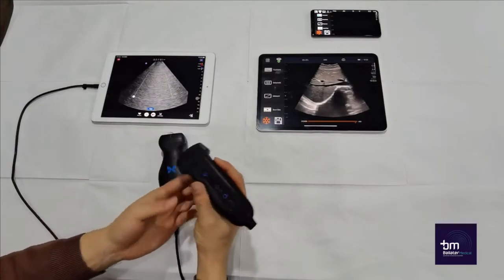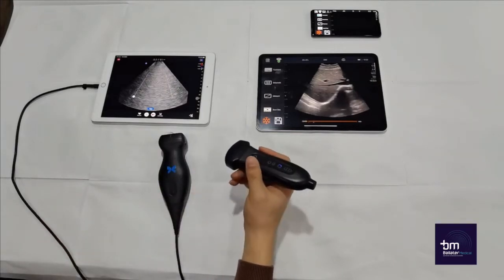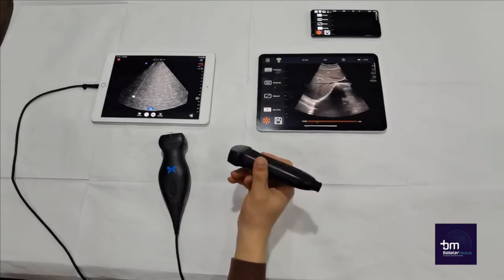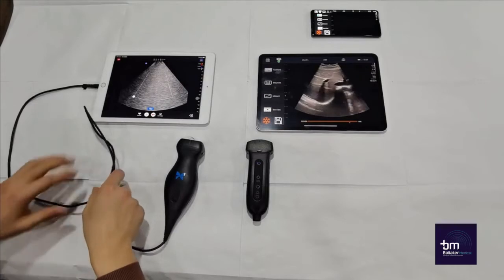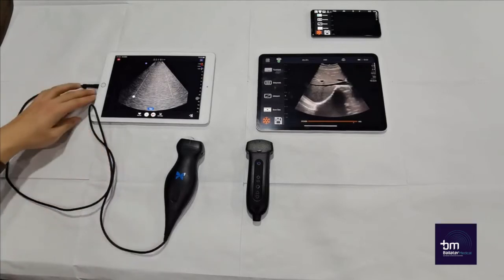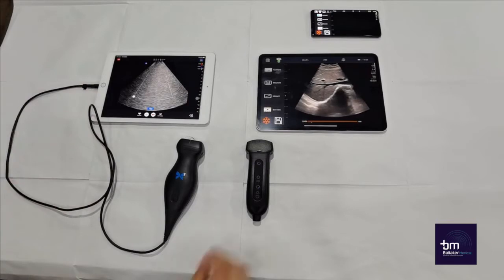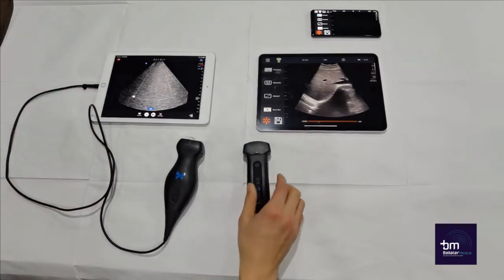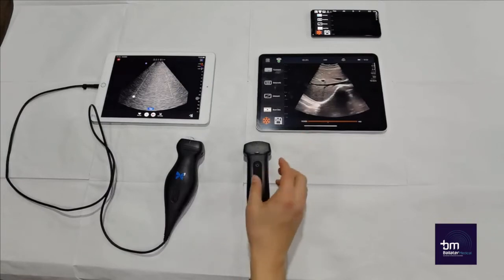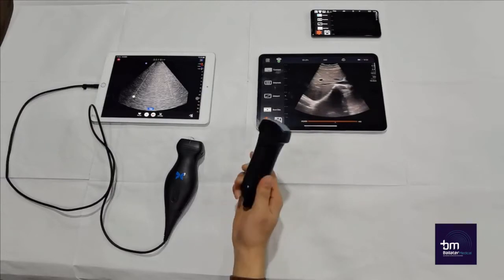The Yuki Q7, however, sits nicely in the hand and also does not have added pull from the cable. As mentioned before, you can see that the Butterfly IQ still has a cable and this is the only way of connecting it to your device. The Yuki Q7, however, has no cable and can connect to any device using its wireless connection. Overall, therefore, the Yuki Q7 offers more flexibility.